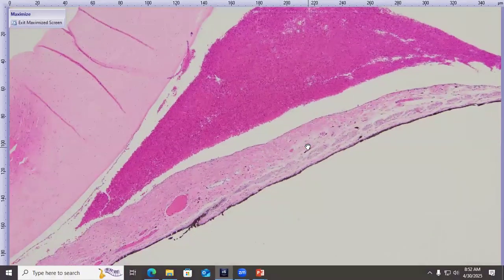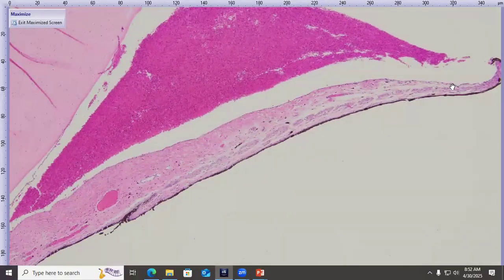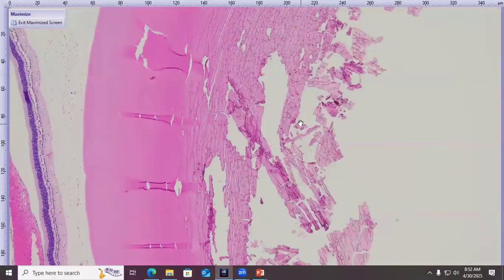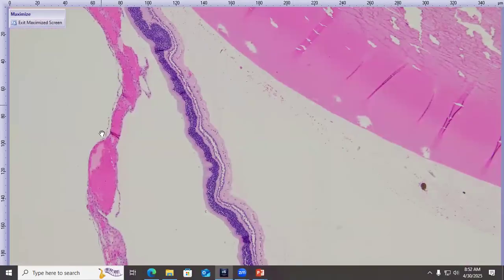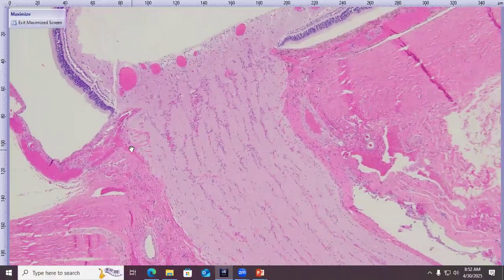So again, hemorrhage in the anterior chamber, so a little bit of hyphema. This is probably a blue eye. There's not much pigment here in the uveal tract. Our lens was unremarkable. No evidence of lens capsule rupture. No inflammation in the eye. Our uveal tract, our choroid back here is fairly congested, but that's about it. Optic nerve head and optic nerve looked pretty well.